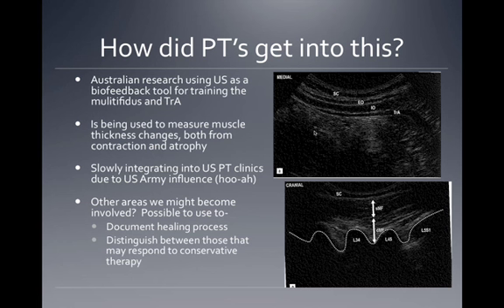We're talking about all these core contractions. And so somebody had the idea, well, let's look at ultrasound and see what we can see contracting. What motions make a particular muscle contract. And now it's turned into a clinical tool as well. Not only can we help our patients visualize that contraction, but we can also, in some cases, do measurements. And that's where a lot of the literature right now is, on people learning how to take these measurements. Are they reliable? Are they valid? Can we use a measurement from session to session? That's where you'll see some of the published literature going right now.